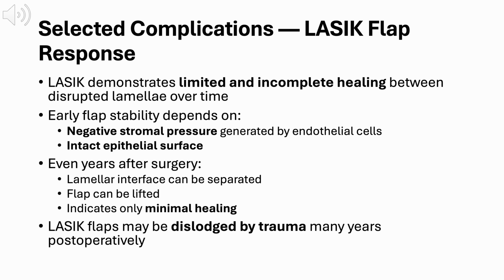Even years after LASIK, the lamellar interface can still be separated, and the flap can be relifted, demonstrating that true stromal fusion never fully occurs. Clinically, this means LASIK flaps remain vulnerable to displacement with significant trauma, even many years postoperatively. This slide highlights a core trade-off in LASIK: excellent optical clarity and minimal haze, achieved by deliberately suppressing wound healing, at the cost of permanent flap dependence on mechanical stability rather than biological adhesion.